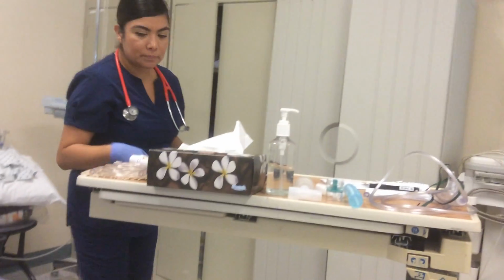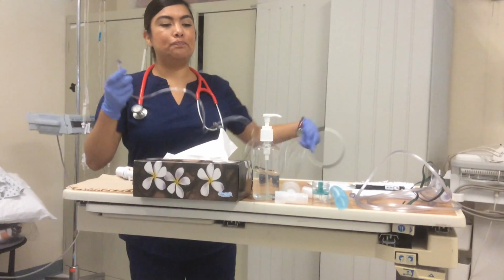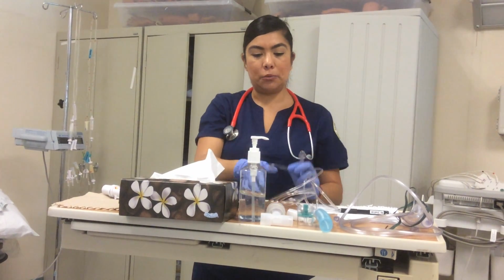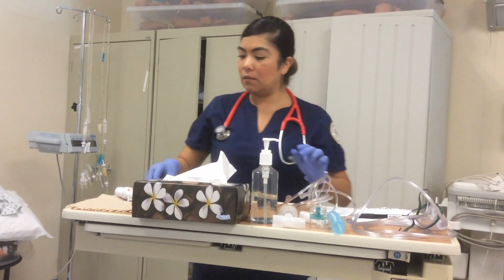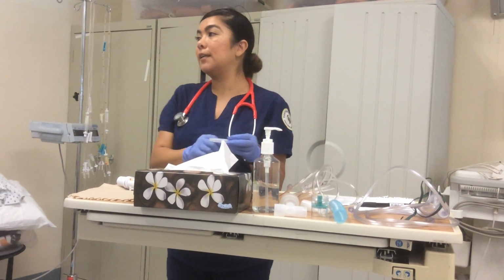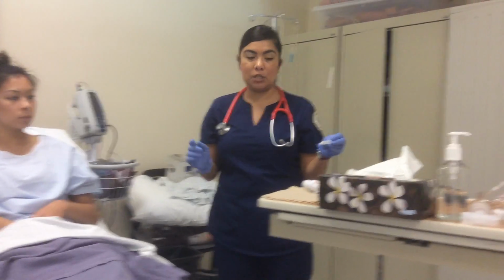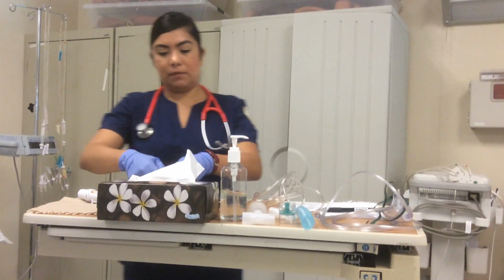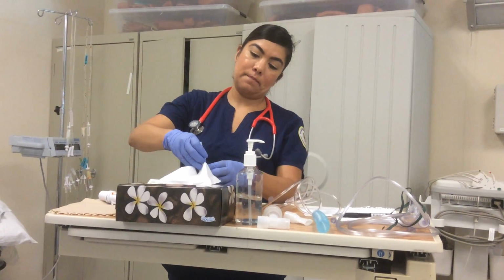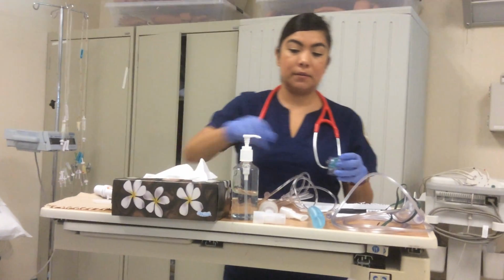Okay, so let me just go ahead and put everything together. Okay, and before I do, I'm going to grab a medication here, and then I would scan it. And then, Miss Adena, can I see your wristband? I would scan that just to make sure that it matches. Okay. And then I'll just get that. And then pour it in there. Very good.